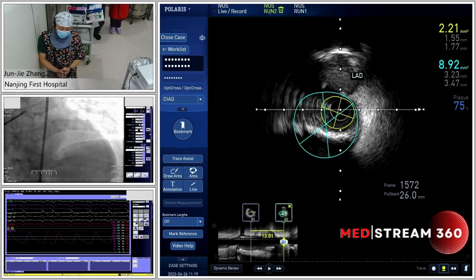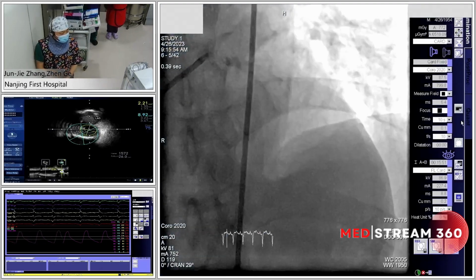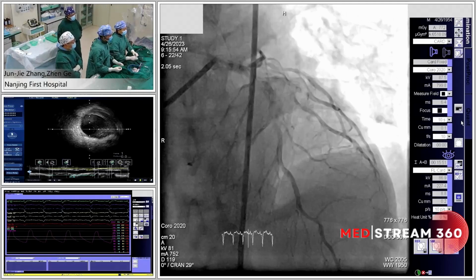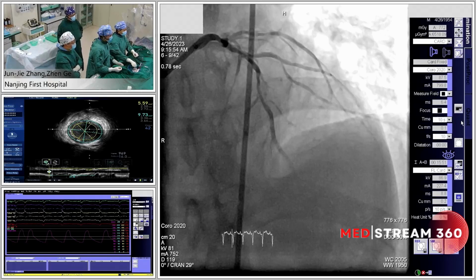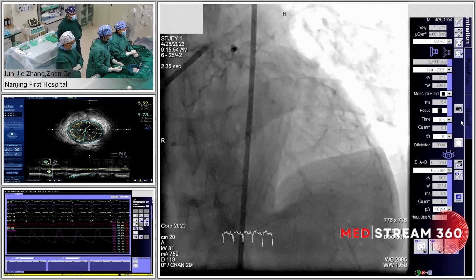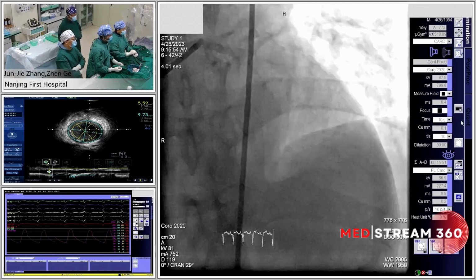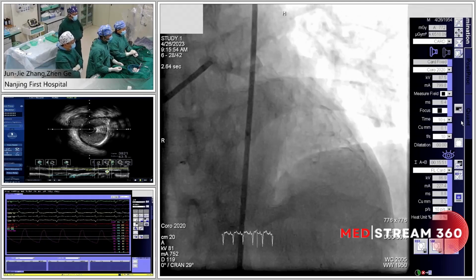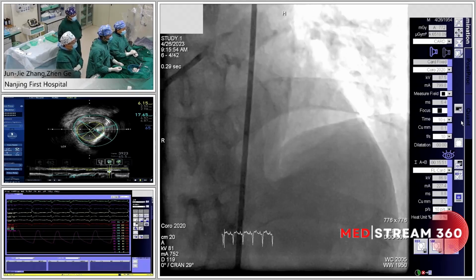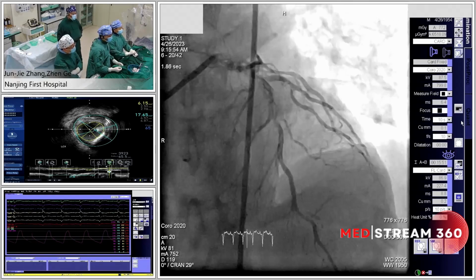Thank you, Dr. Pan, for the introduction. Based on the IVUS information, we can precisely define the lesion length, define the landing zone and also the stent size. But the most important thing is the calcification, because angiographically it's a typical severe calcification, and the IVUS shows at the proximal LAD, especially just before the orifice of the first diagonal, a circular superficial calcification. From this point, Dr. Ge, what's your strategy for this severe circular and superficial calcification?